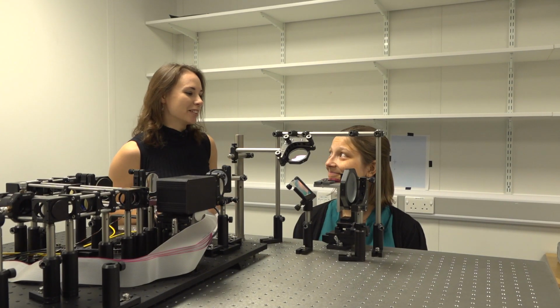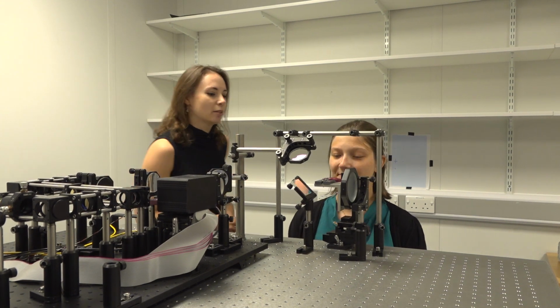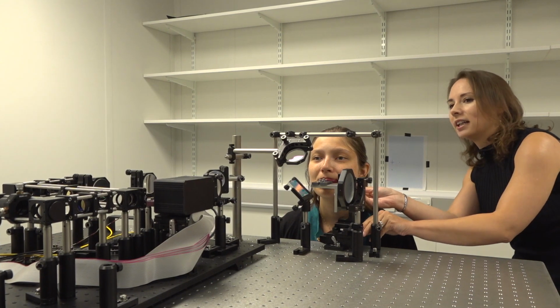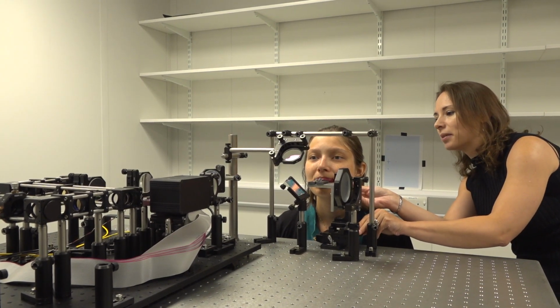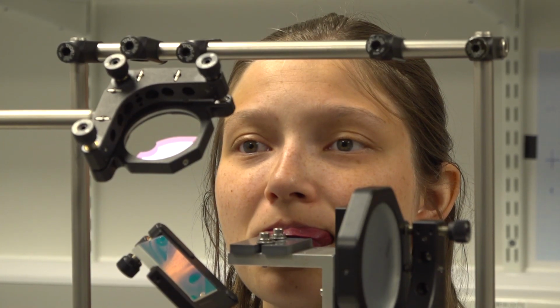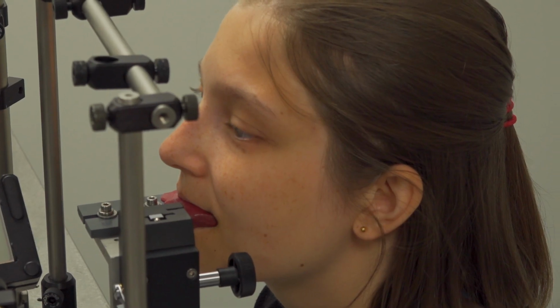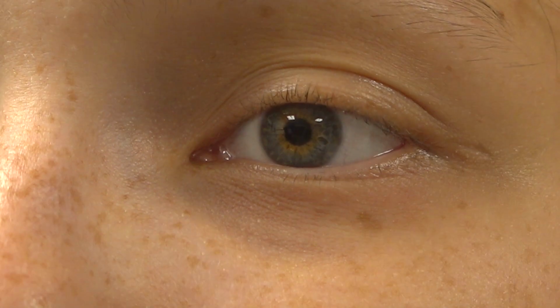Okay, Anna, we're going to take a picture of the back of your eye. So if you'd like to come forward and bite onto the dental impression, I'm now going to align your eye lens to the system so that we can get the best possible image that we can. I'm now going to put a fixation cross on the screen in front of you. If you could just keep your eye fixated on that while I take some images.